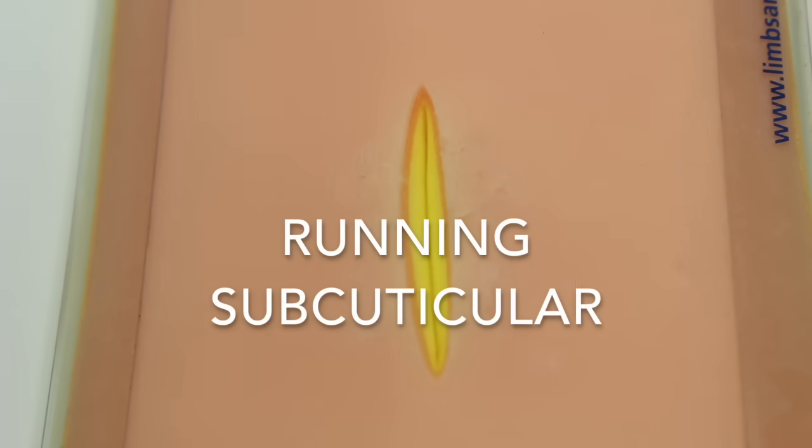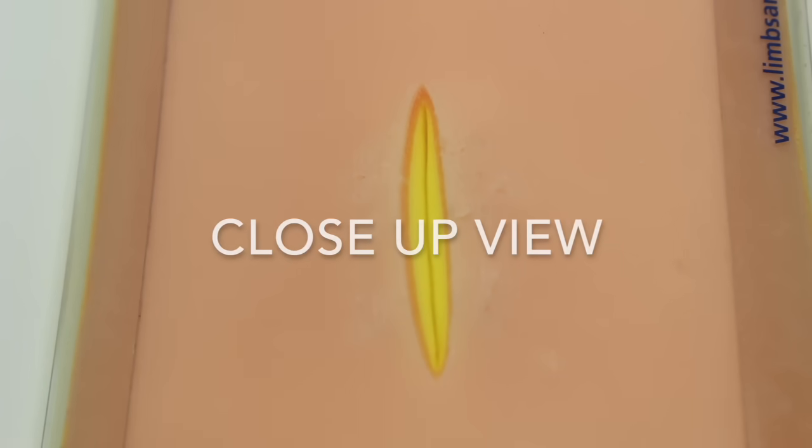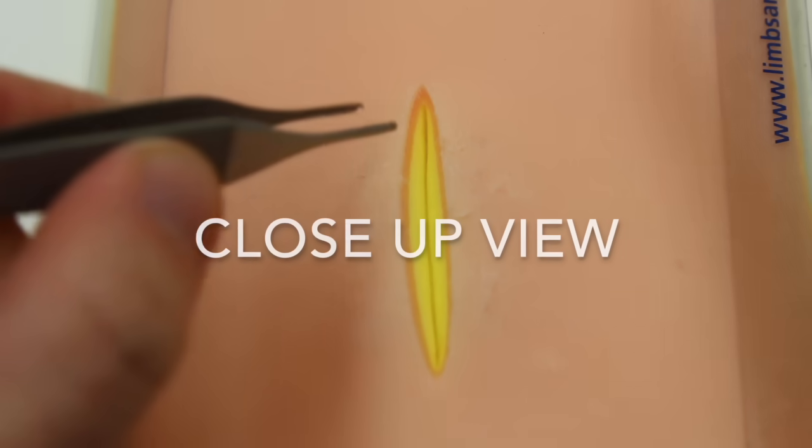So the last kind of suturing I'll show is the running subcuticular. This is what you'll use most frequently in closing surgical incisions, so I'd practice this quite a bit.